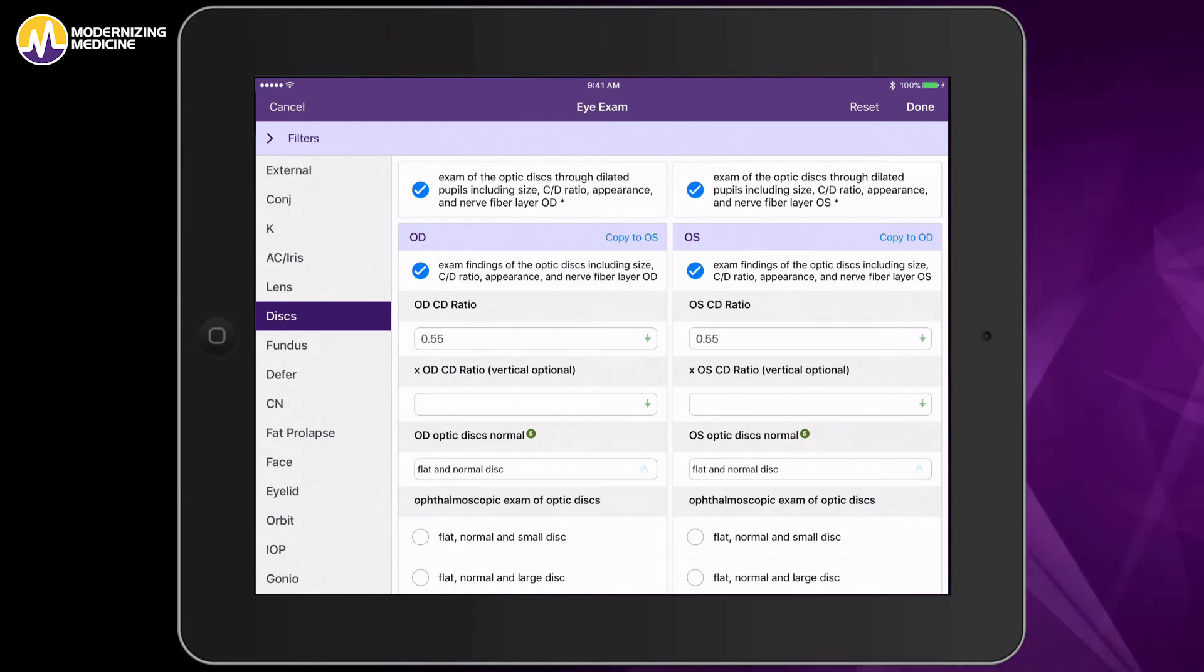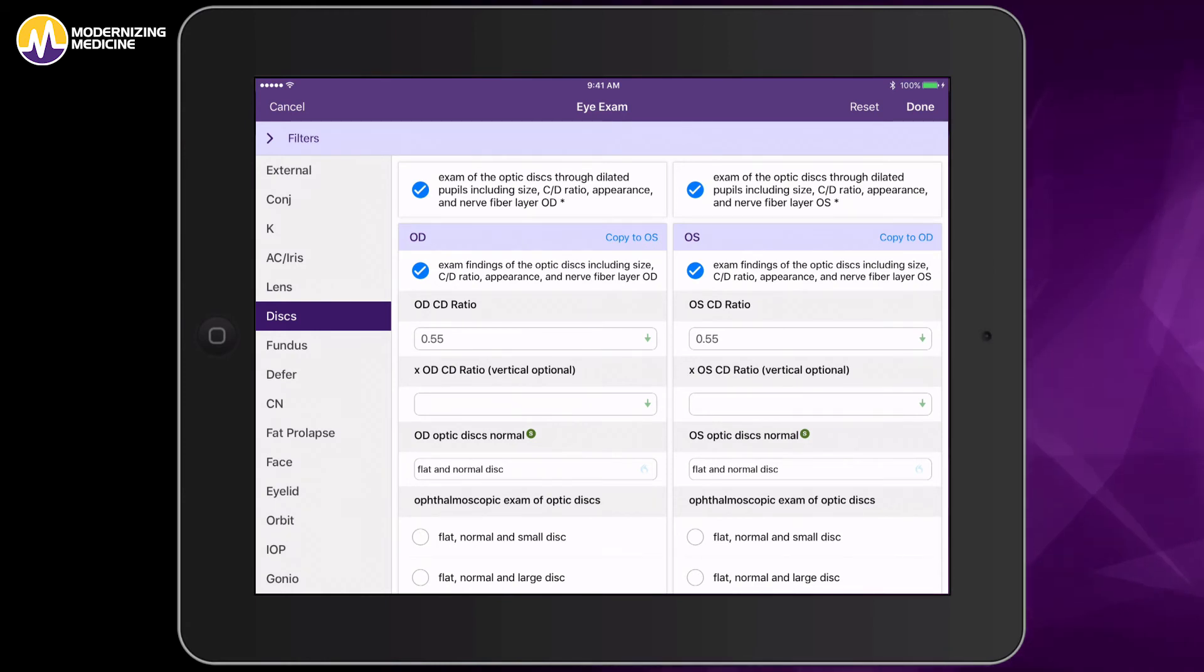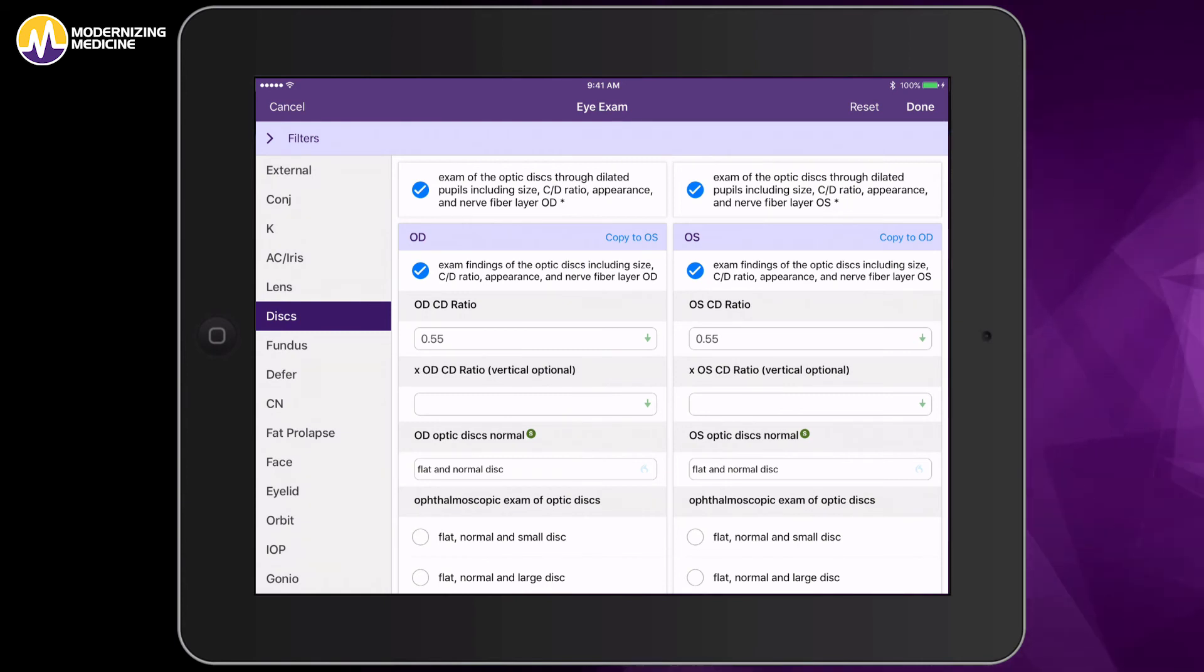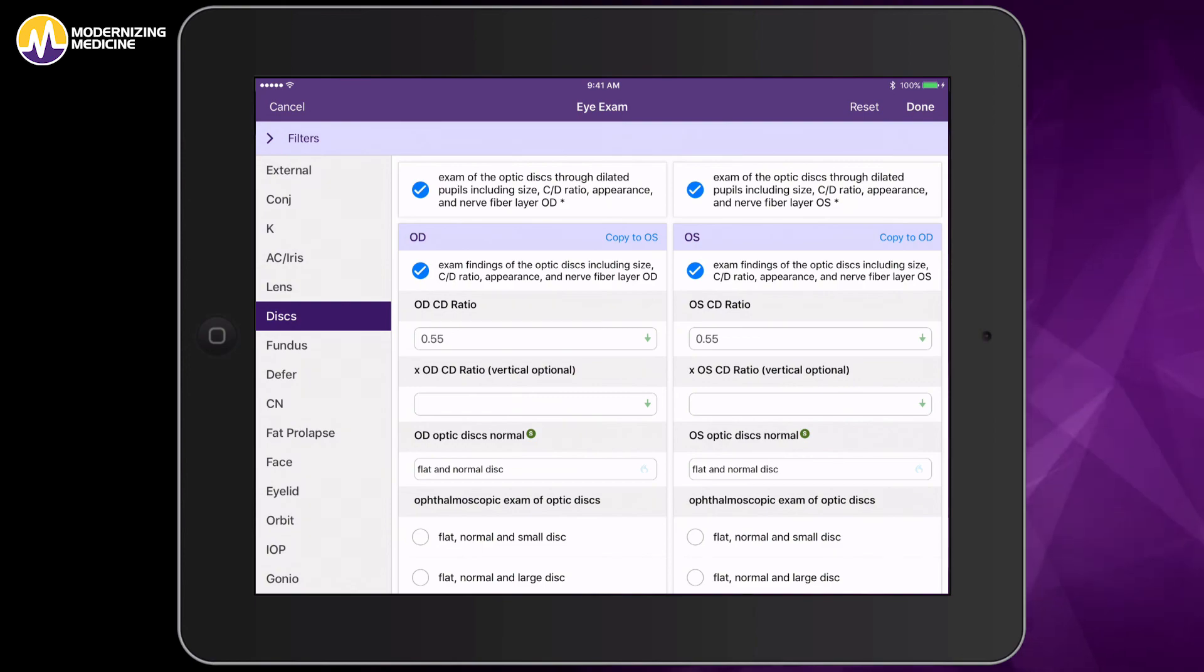As you can see, our Ophthalmology EMR, EMA, will help you streamline workflow and enhance patient care.